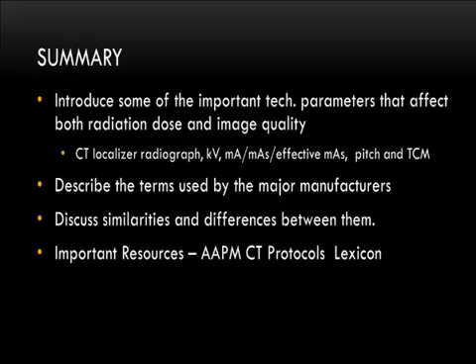So since nobody's jumping up to the mics, I'm going to ask a question. I'm pretty sure I heard somebody from Siemens say once that the standard size patient that the quality reference mAs is based off of is the standard man who is 5'8", male, 20 to 30 years old, and weighs about 150 pounds. This guy never goes into my CT rooms? Is that the correct interpretation of what the quality reference mAs is supposed to size to? Yes. Okay. So just making sure everybody's aware of that.